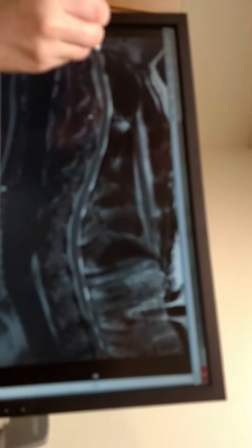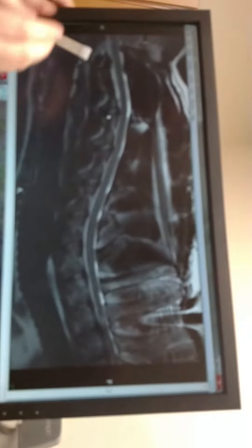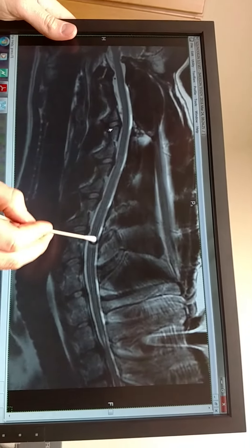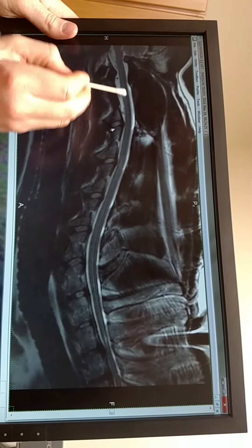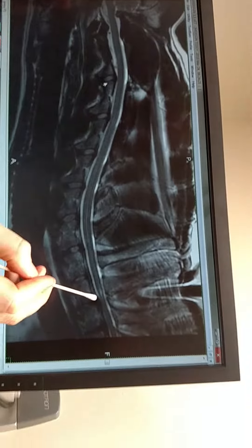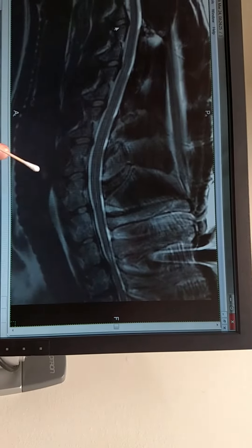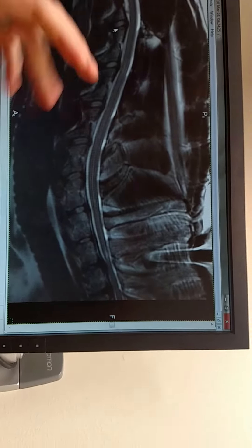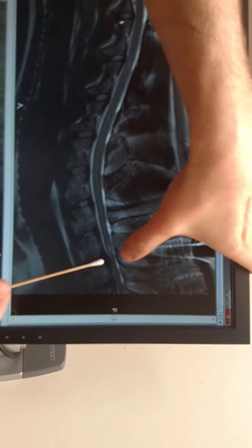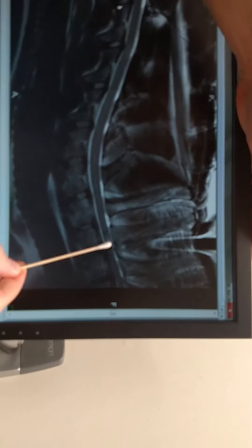This is the front, back, top, bottom. This is the spinal cord running through here. All this area is totally normal until you get to right there. See this? It's a little divot. Not only is there a divot, the spinal cord is narrow at that site, and there's a white streak right there.